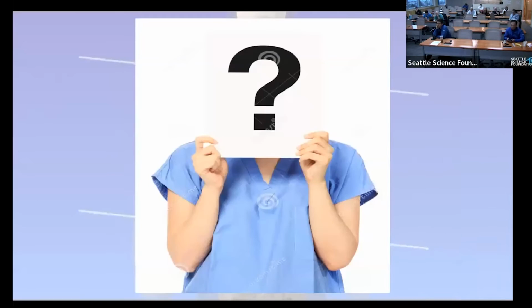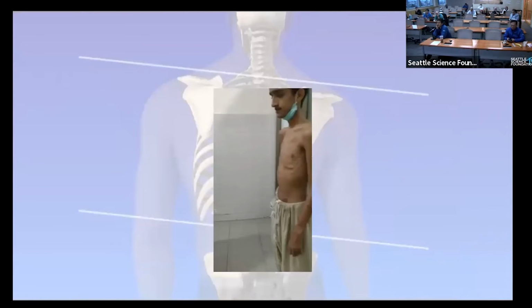Great. Thanks so much, Dr. Maleeb and Dr. Sohail. That was an excellent presentation. Were there any changes in the neuromonitoring during the case? Unfortunately, we do not have neuromonitoring in our setup. All we rely on is the visibility of the dura in front of us. As you must have noticed, we like to have wide laminectomies so that we have the dura in front of us while we are manipulating it.